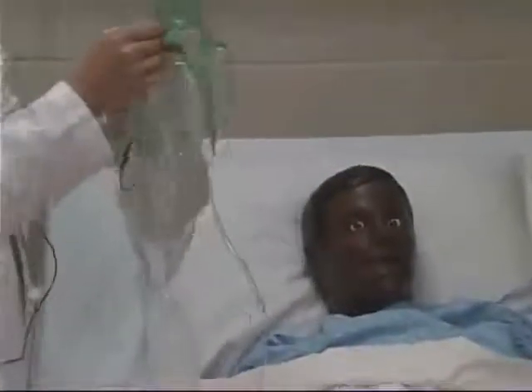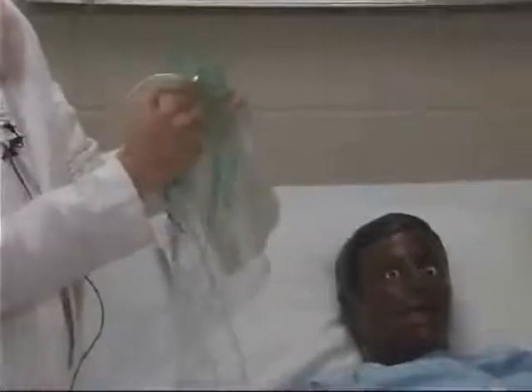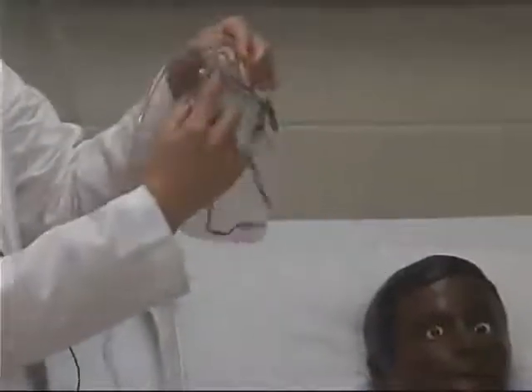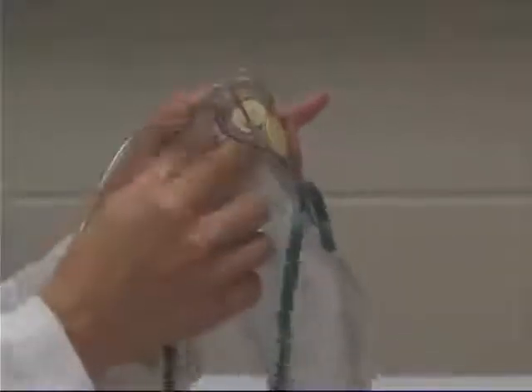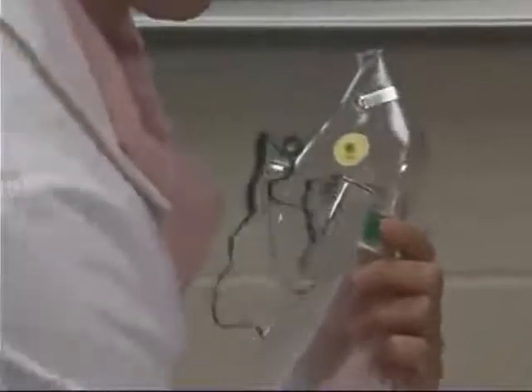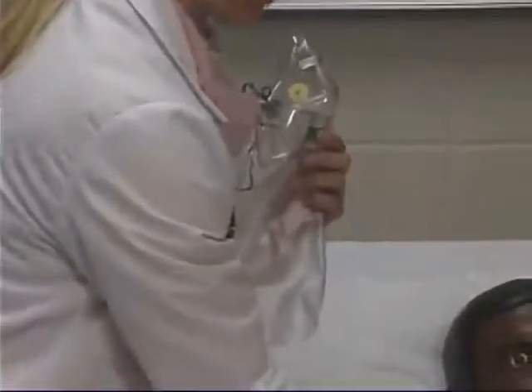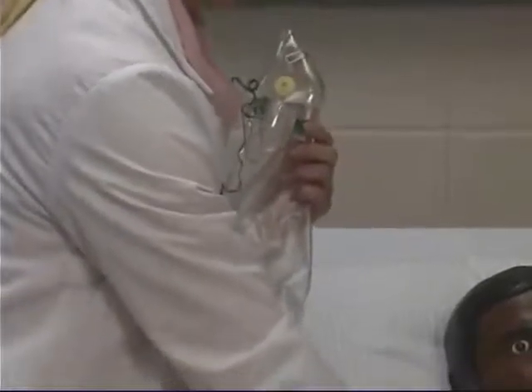As I said before, in the partial rebreathing mask, there's no valve here. However, with the non-rebreathing mask, there is a valve. What this valve does is it prevents exhaled air from the patient from going back into the bag and mixing with the oxygen. So with this mask, because exhaled air can go back into the bag, you have a mixture of the oxygen and carbon dioxide.